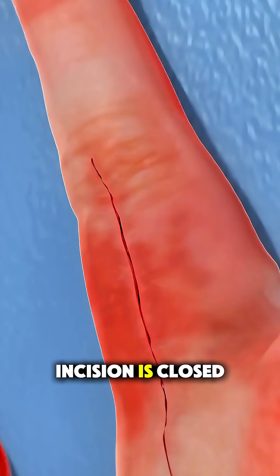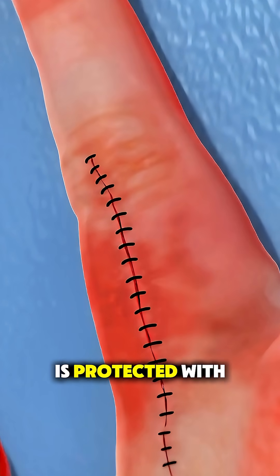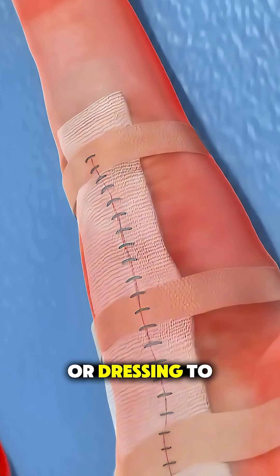After that, the incision is closed and the finger is protected with a splint or dressing to prevent movement.